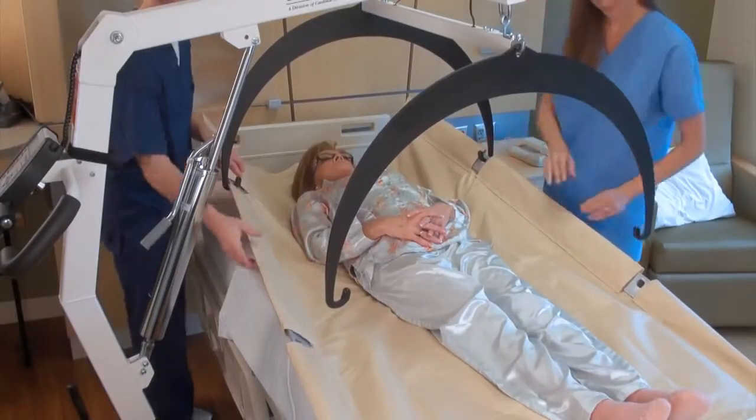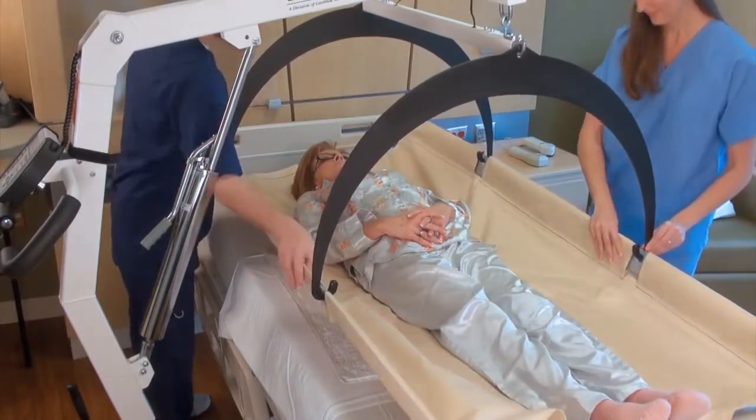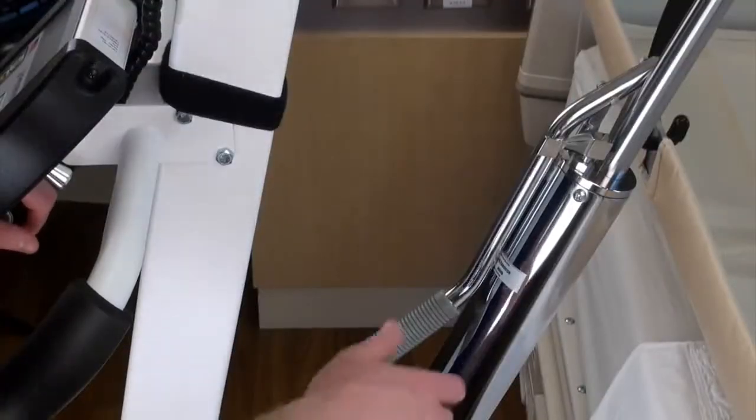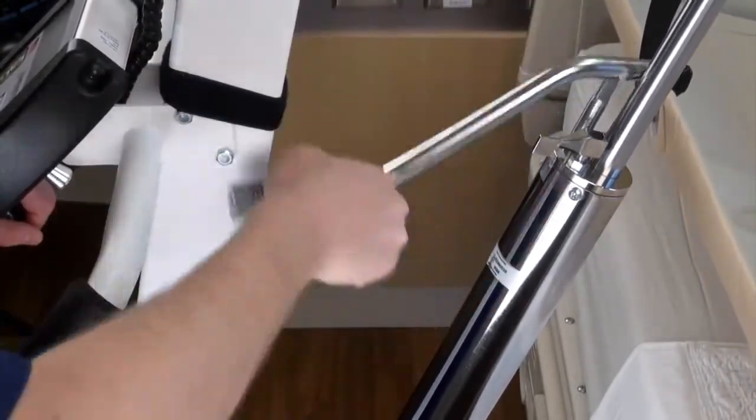Once more, connect the stretcher to the support hoops using the holes in the stretcher support bars on either side of the patient. Ensure that the valve is closed and begin pumping the handle with slow strokes of even pressure to gently raise the patient from the bed.